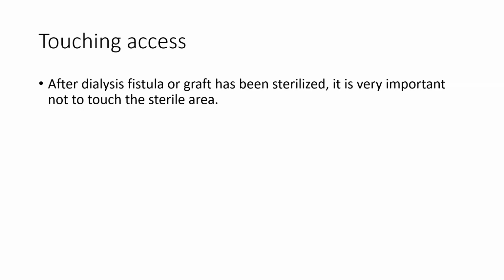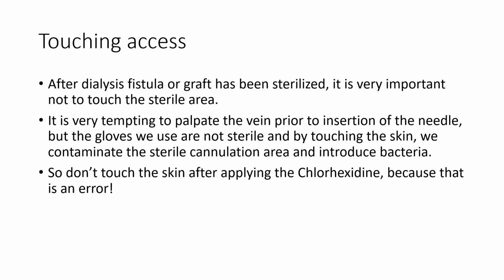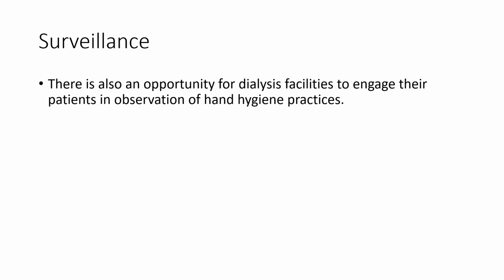Just a general reminder for the nurses and technicians out there: after you have sterilized the dialysis fistula graft, it's very important not to touch the sterile area, even if you are wearing gloves. It's very tempting to palpate the vein prior to insertion of the needle, but the gloves we use are not sterile, and by touching this skin, we contaminate the sterile cannulation area and potentially introduce bacteria. So whatever you do, don't touch the skin after applying the chlorhexidine, because that is a common error in dialysis units.